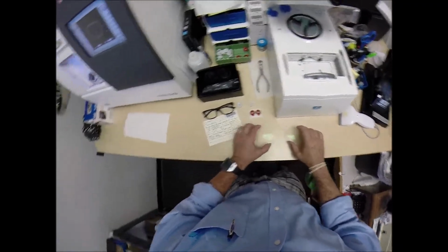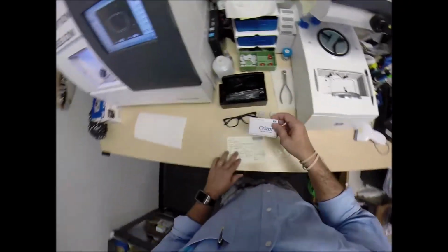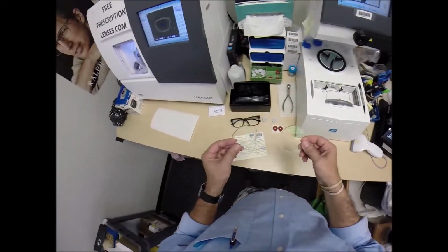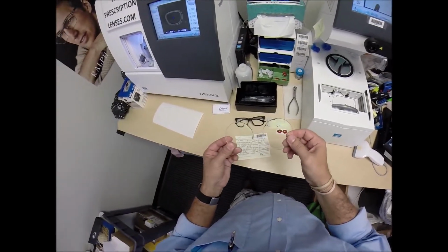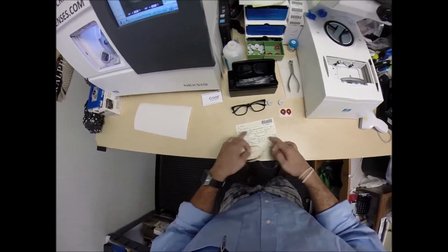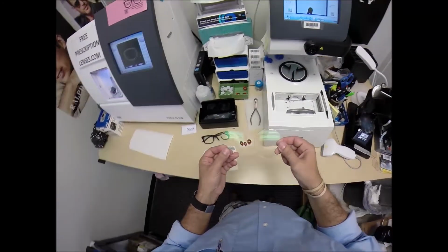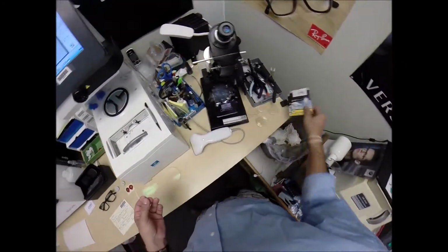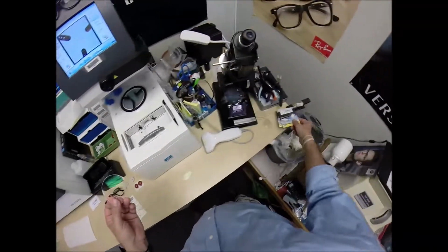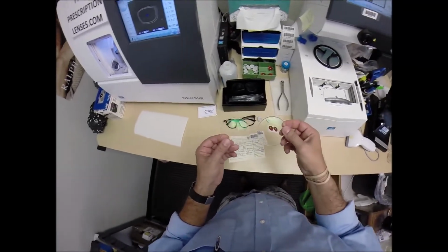Now your lenses have the Crizal Avance, and shame on me, I did not have the Crizal cloth out. I should have, but these are the same prescription in each eye. You have no power correction, but you do have 2.5 diopters of astigmatism in both eyes. So I can get a stock lens, meaning that it comes in a paper packet. With Crizal, it goes up to 2 diopters, but because you have 2.5 diopters of astigmatism, I had to have these custom made for you.